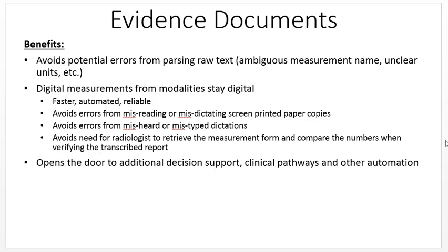Here are the benefits of the evidence document profile. Evidence documents can be stored, shared, and used in a lot of different ways. Depends on what type of modality it's coming from.